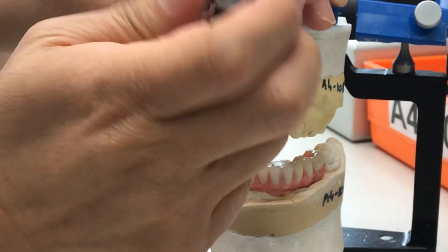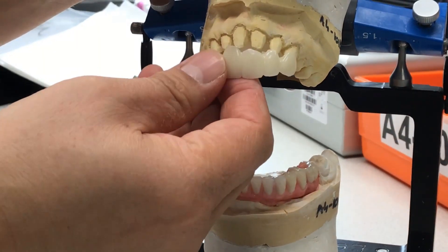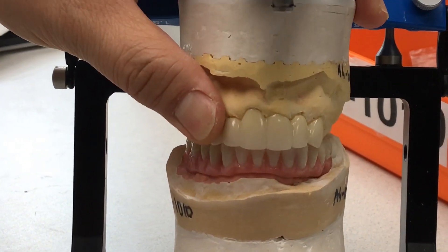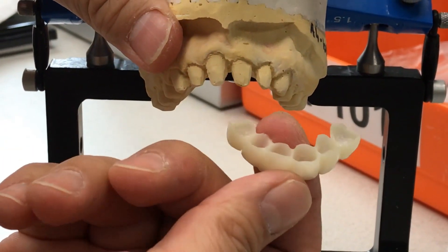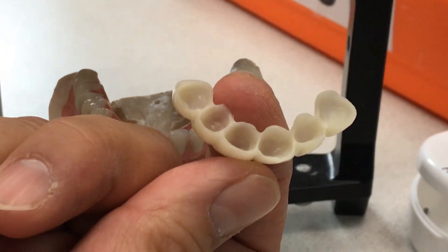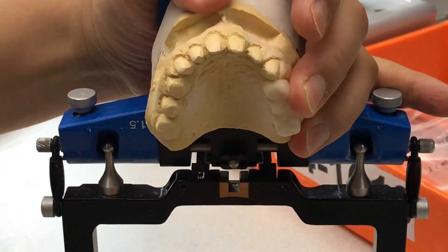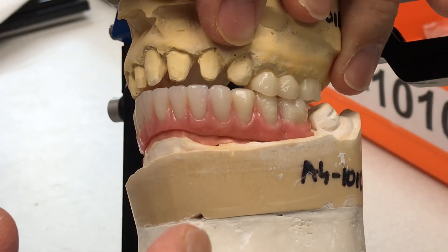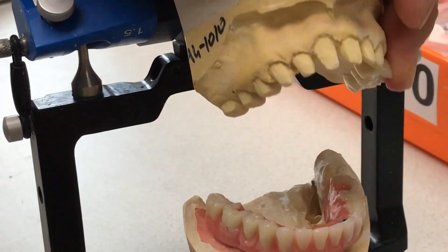So for a better clear idea — it's a six unit, so I have to prep it to make it cosmetically aesthetic. We set up the teeth and ground as much as possible so the doctor can reline underneath. On the right side, we made a three-unit and achieved a class one bite.